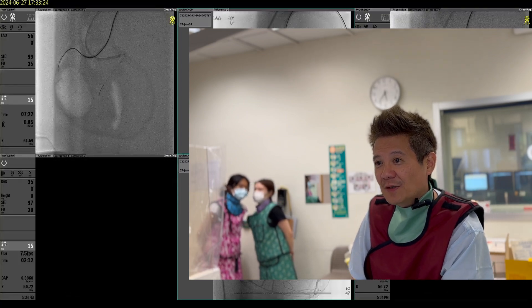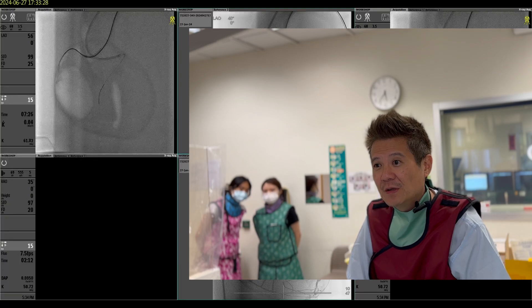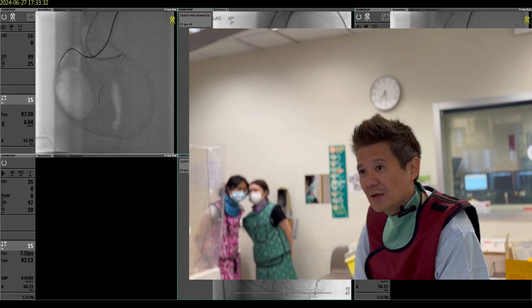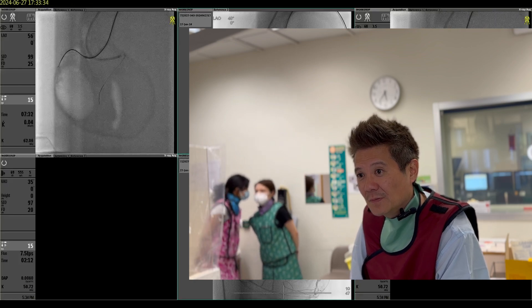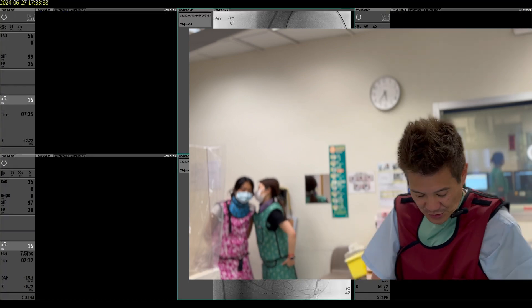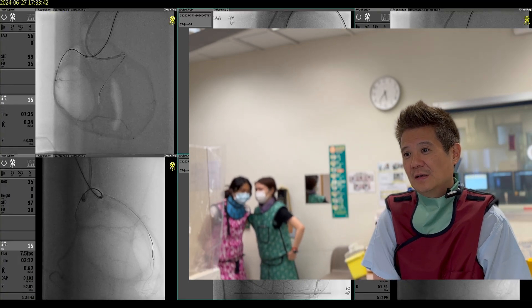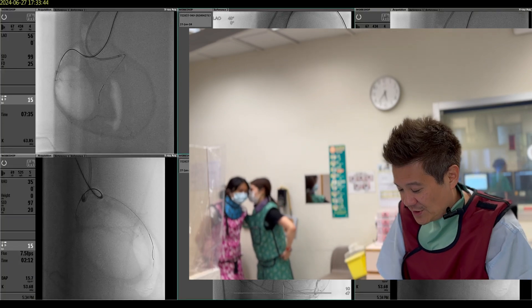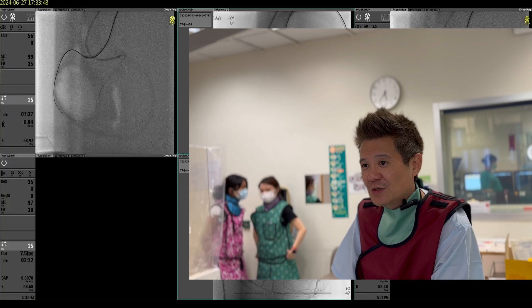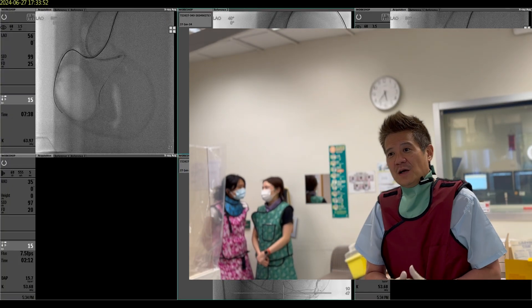Both are centered — LAO centered and RAO centered. We should go forward; either view works now, but we want more support before we go. This should be the puncture. We can see that we are now in the true lumen, and we can wire down.